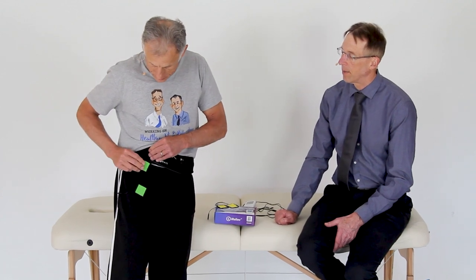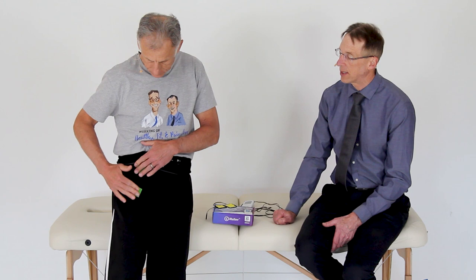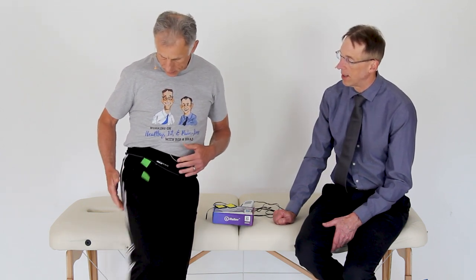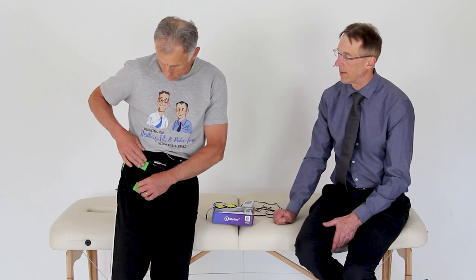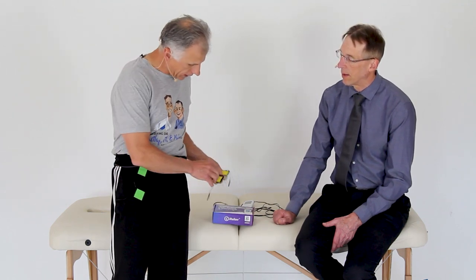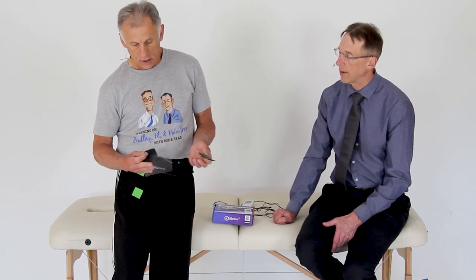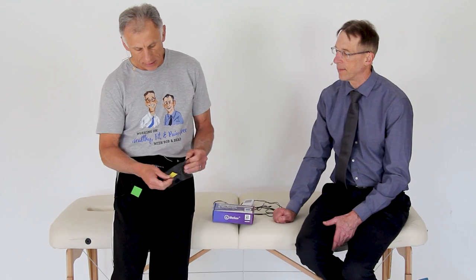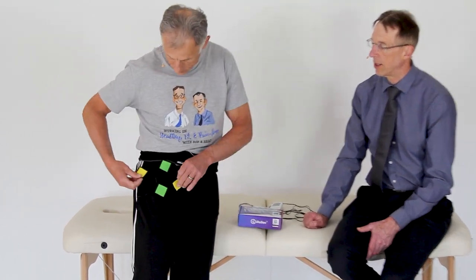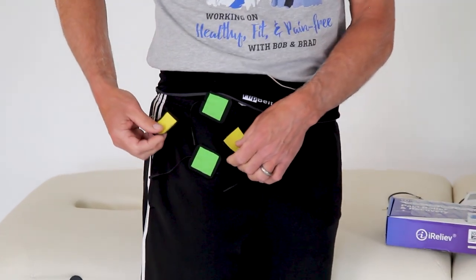Yeah, that's true. It's a good point, Bob. But if you're going to walk around, or you're going to be sitting, obviously you can't put one in the crease there. You can flex there, and it won't get into the crease. You could go there and there. They do have a plastic sheet here, so keep the pads always either on this or on your skin. Don't leave them lying around, or they'll dry out. This helps protect them by keeping them on the sheet.